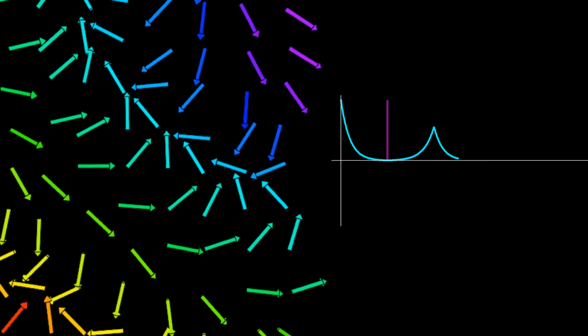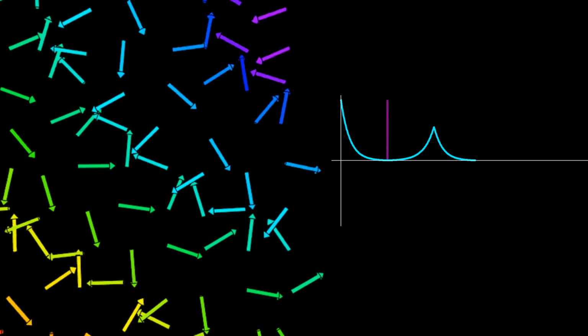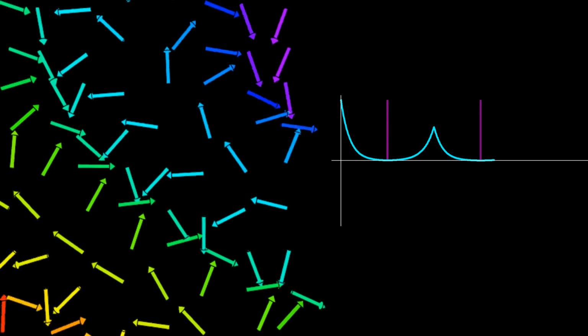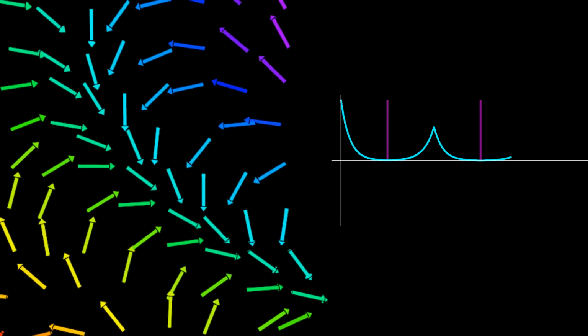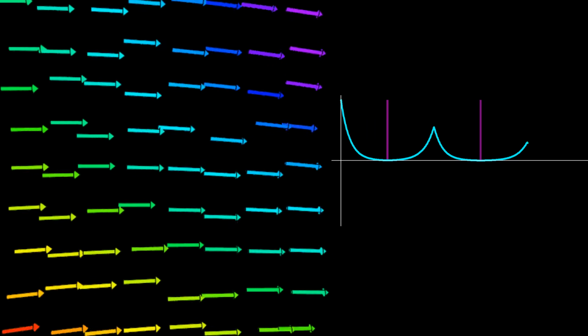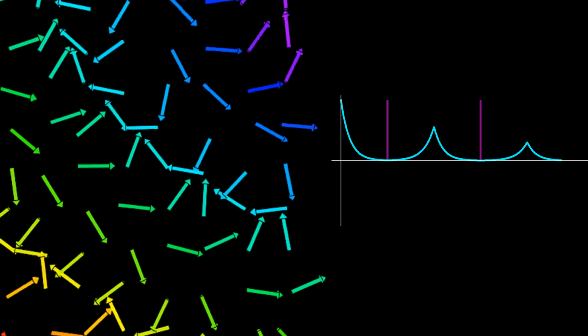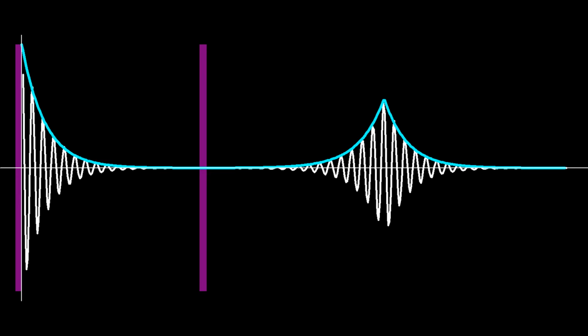There's two important things to notice about the plot that I've drawn here. First, you might notice that the dephase-rephase parts of the plot seem to be mirrored around the 180 pulses. Second, you see that our echo peaks get smaller in time. So what's going on? So as we've seen, the detected FID follows T2 star decay.